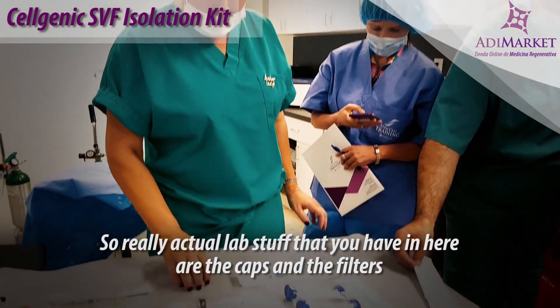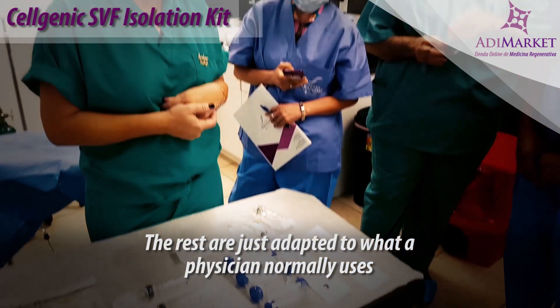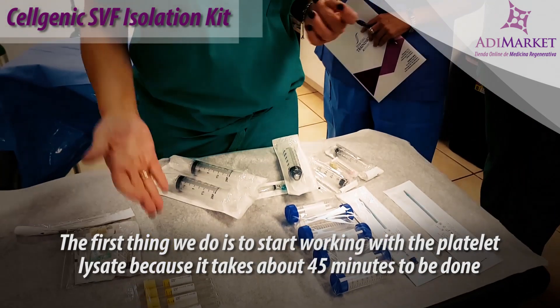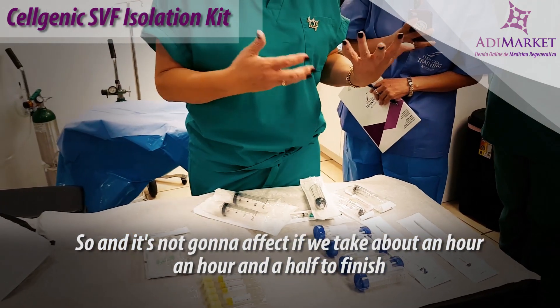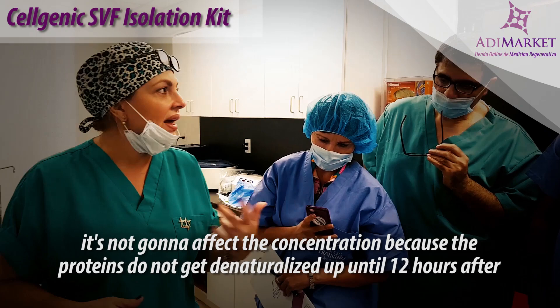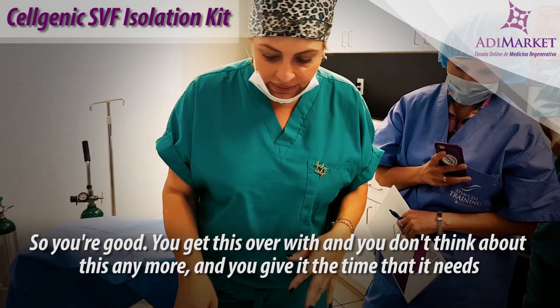The actual lab items in here are the caps and the filter — the rest are just adapted to what a physician normally uses. The first thing we do is start working with the platelet lysate because it takes about 45 minutes to be done. It's not going to affect the concentration if we take about an hour to an hour and a half to finish, because the proteins do not get denatured up until 12 hours after. So you get this over with, don't think about it, and give it the time it needs.